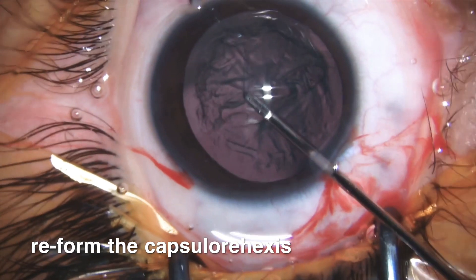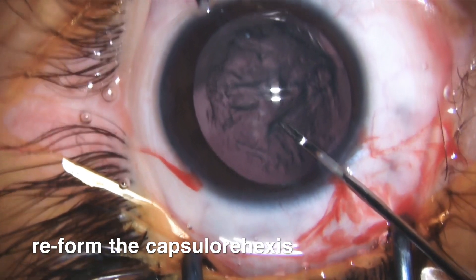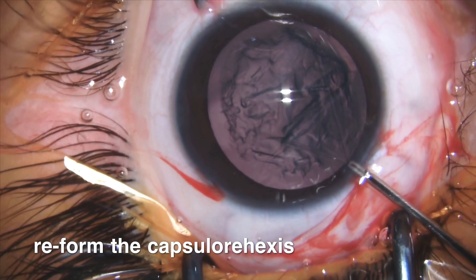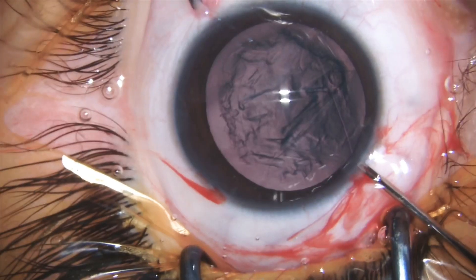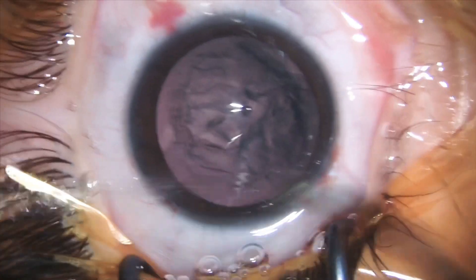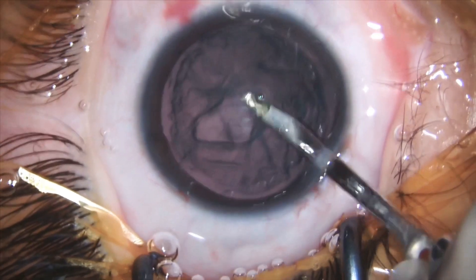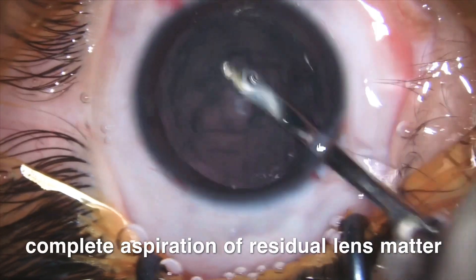And then placing the lens in the back. Now the intracapsular pressure is stable again after OVD injection, reforming the anterior capsulotomy. The plan is to sweep the cortex and epinucleus from the periphery to the center.